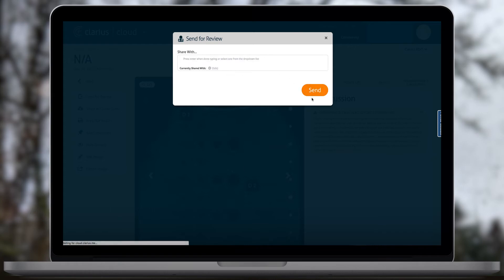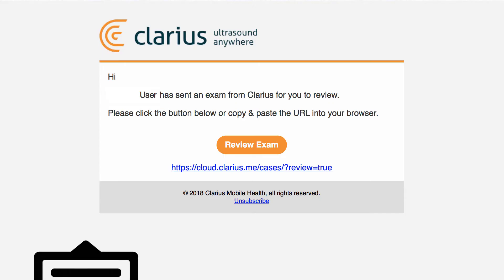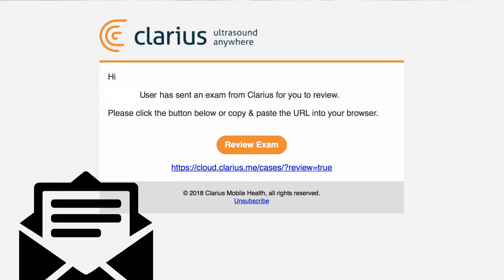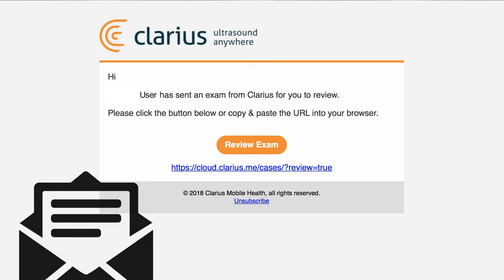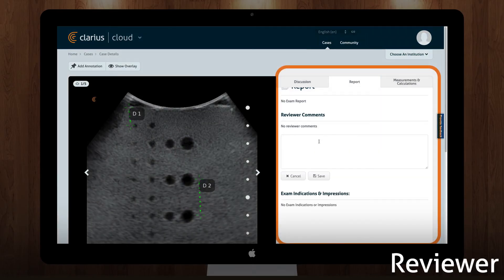You can share exams with people in your institution. You can also share exams with people outside your institution by typing in their email address. They will receive an email with a link to view the exam. As a reviewer, you have a limited view of the exam, with patient information redacted.